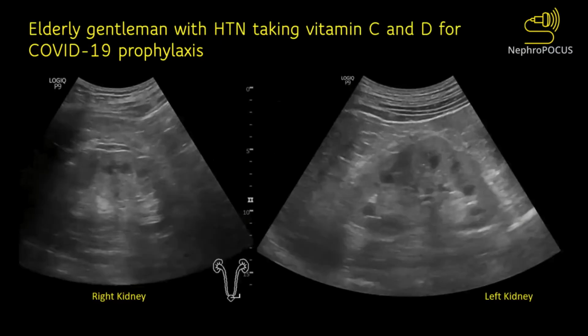And another interesting case of intrinsic renal cause. Here is an elderly gentleman. I saw this patient in the clinic very recently. He's otherwise healthy, about a 70-year-old Caucasian male. Hypertension is also very well controlled. No hypotensive episodes or anything, but presented with AKI. The creatinine rose to 3 point something when I initially saw him, and the baseline was about 1.1-ish. And the kidney showed markedly increased echogenicity on clinic ultrasound.